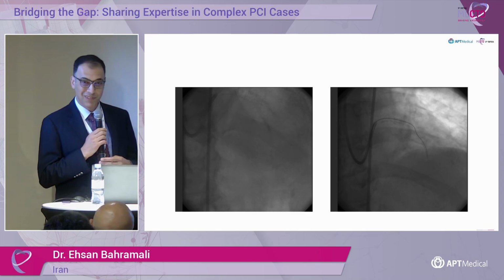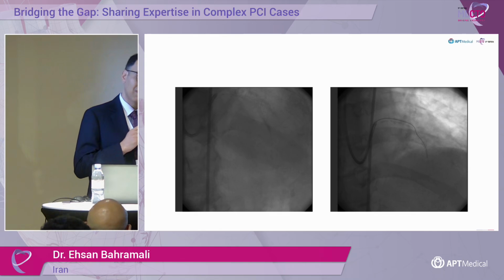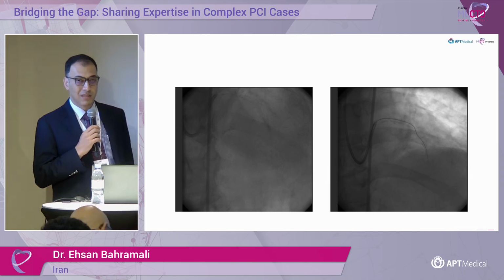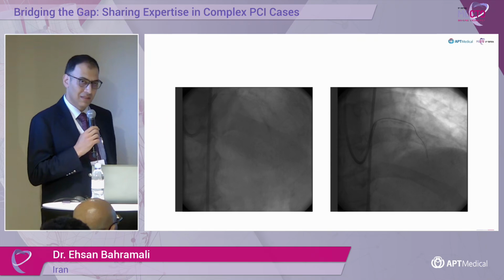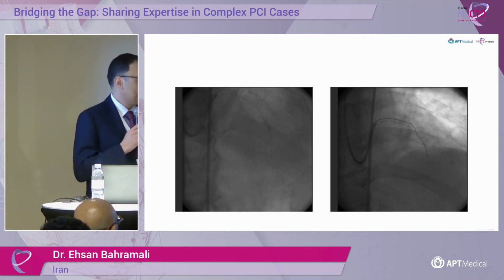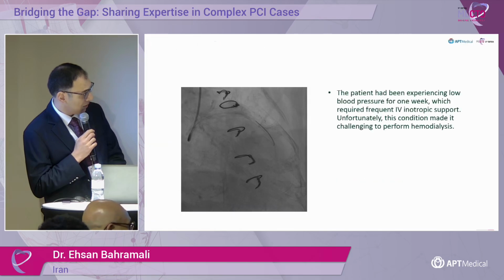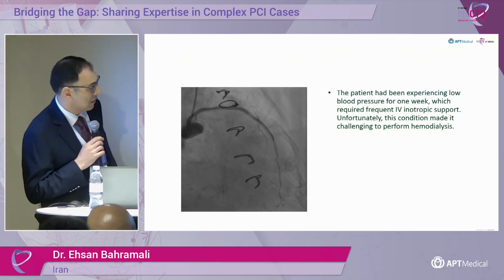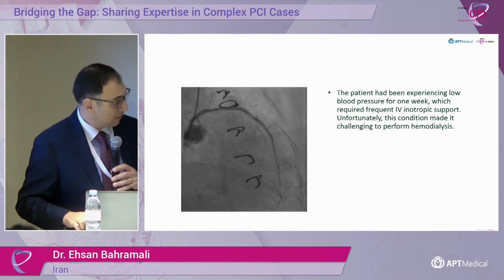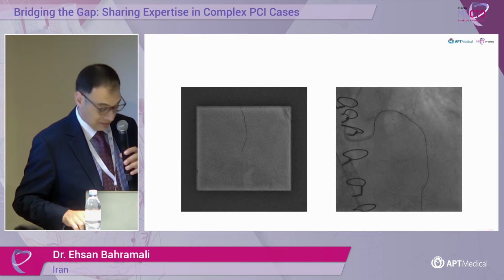It was the thing we couldn't comprehend, what was the reason for the hypotension. Yes, yes. The ejection fraction was the same. No pericardial effusion. Not a major side branch here. You can see the final results here. You have no diagonal, so maybe some are in the subintima. There are no diagonals at all. We can see the first images to see if diagonals were present in the first place or not. We have an injection here.